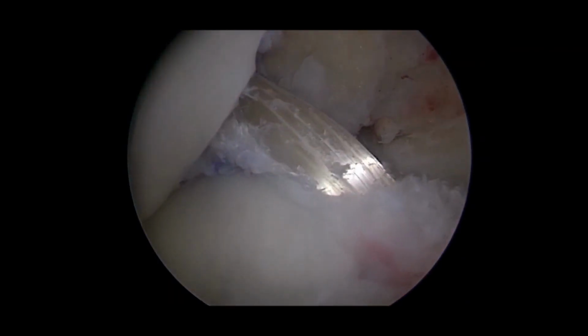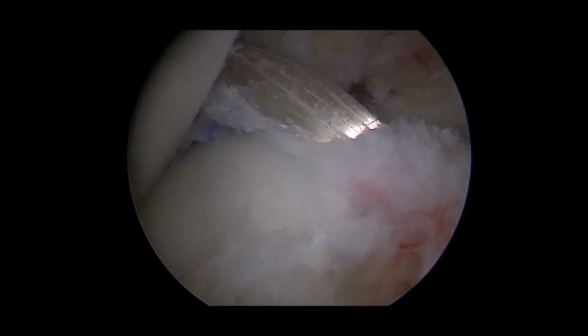Now the knee is being extended and it is being checked if there is any impingement of the graft with the femoral notch. As you can appreciate, there is no impingement of the graft with the femoral notch. After cycling of the knee, the graft has been fixed on the tibial side with the help of an interference screw.